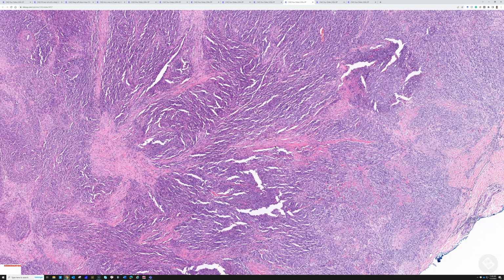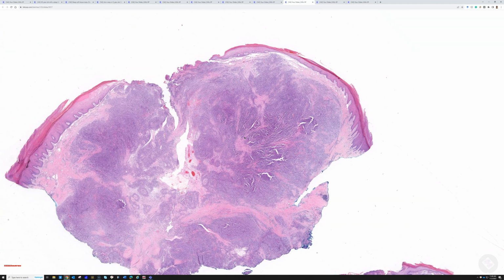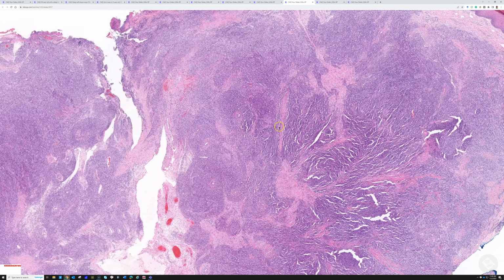The one main caution I want to say is that it's a very sensitive marker for vascular endothelial cells, but it is not specific. It can be positive in a variety of other things, including prostate carcinoma, epithelioid sarcoma, and many others. So just remember that ERG is very sensitive but not specific. In a hard case, I'll use all three vascular markers, ERG, CD31, and CD34. But here we actually don't need any of them. All we need is an HHV8 immunostain. No immunostain is perfect in pathology, but HHV8 is about as close to perfect a stain as we can get. It works very, very well.